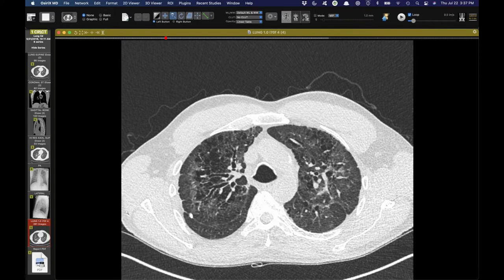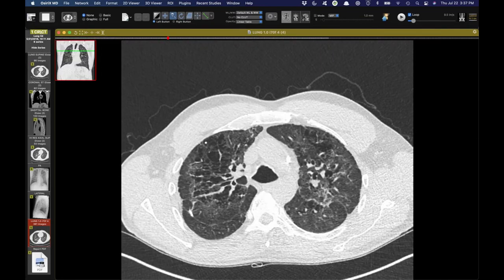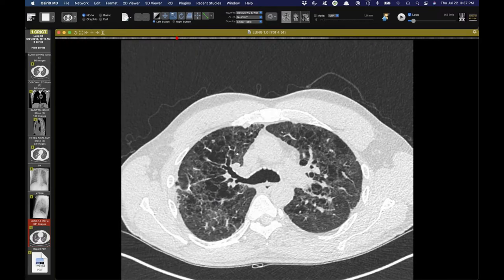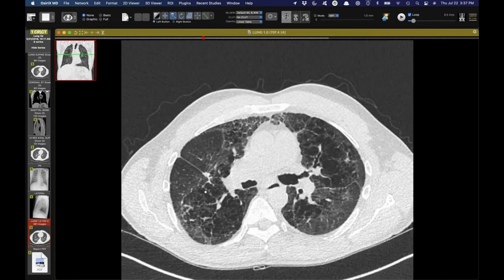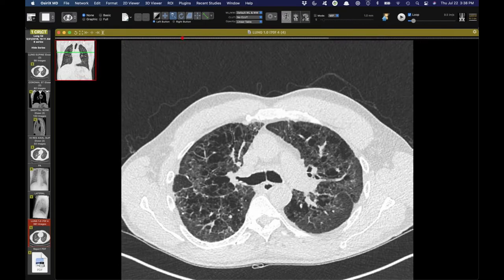I think this is some weird emphysema, and it's a sort of central distribution. I like your idea. It's too bad there's not more airway dilation to go along with the elastic tissue problems. Well, I think it's bizarre. I'd wonder about amyloidosis, because it should be considered, though the distribution is a bit odd. I think of amyloid anytime you have emphysema that doesn't appear to be ordinary cigarette smoking related emphysema, with cystic spaces as a component of the pathology.